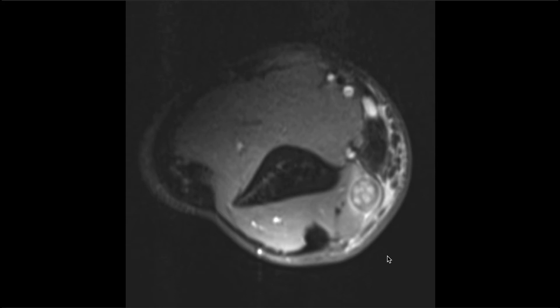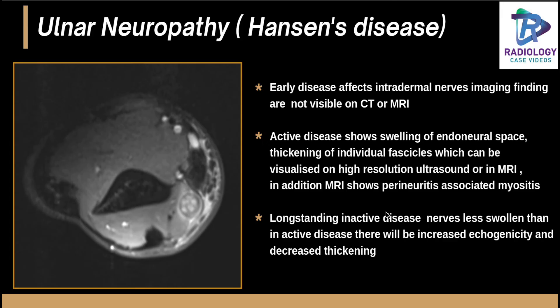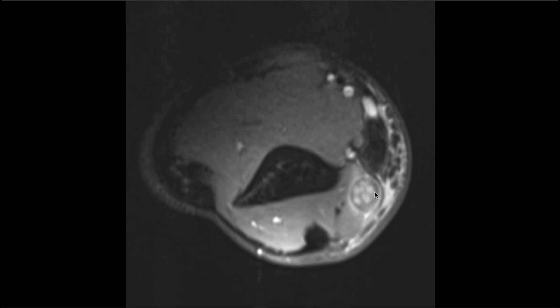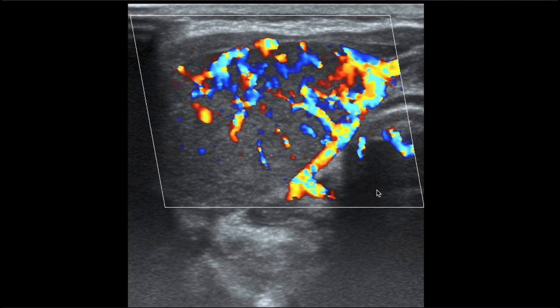Coming to the third case: this patient had neuropathic symptoms and was sent for ultrasound, where a thickened nerve was found. MRI was performed to delineate the thickening further. You can see the enlarged ulnar nerve with numerous fascicles within, and there is perineuritis and subcutaneous edema — classical features of ulnar neuropathy secondary to Hansen's disease. Early disease affects intradermal nerves, which are impossible to diagnose on imaging. In active disease, individual thickening of fascicles can be visualized on high-resolution MRI, along with a vascular pattern.